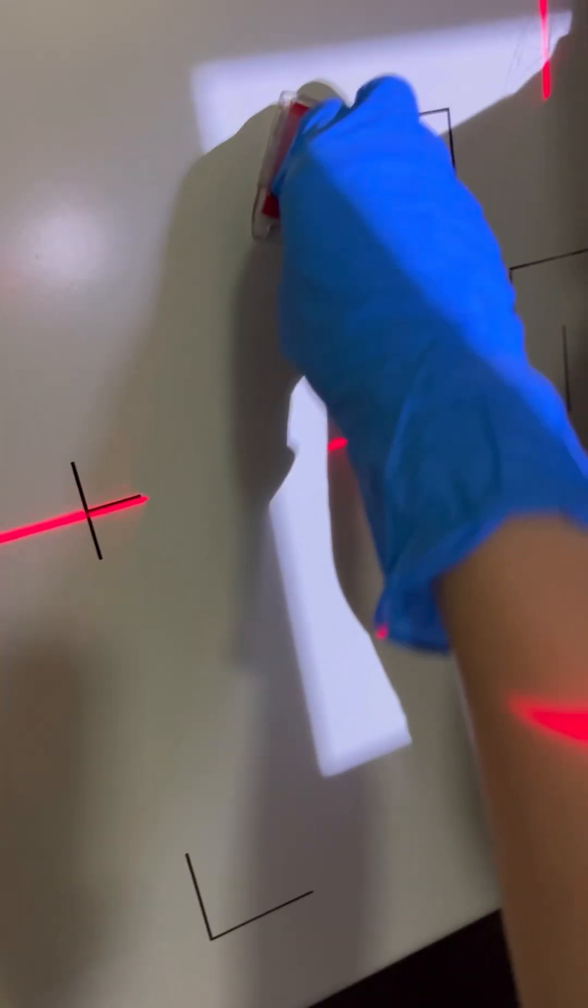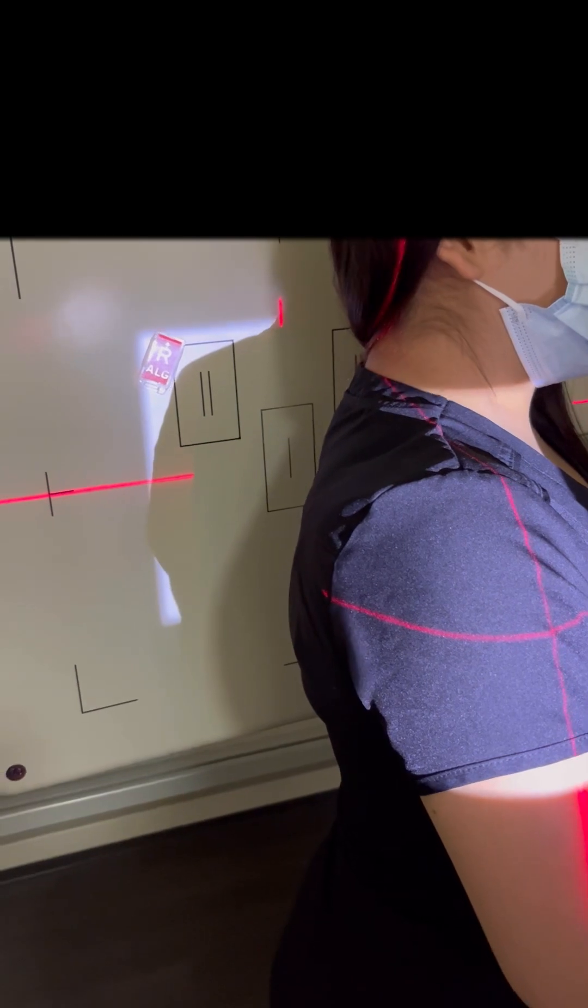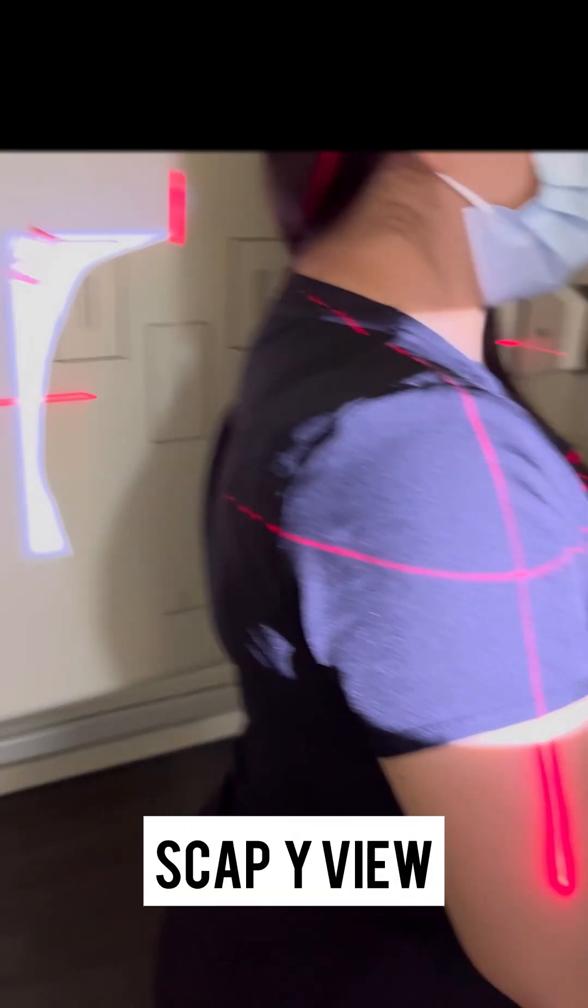Then just put your marker like that, and then you try to collimate, and that should be a good scapula.